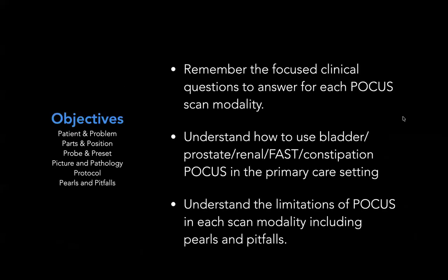The objectives of today are to remember the focused clinical questions to answer for each POCUS scan modality that we'll be discussing, understand how to use bladder, prostate, renal, FAST, and constipation POCUS in the primary care setting, and then understand the limitations of POCUS in each scan modality, including the pearls and pitfalls.